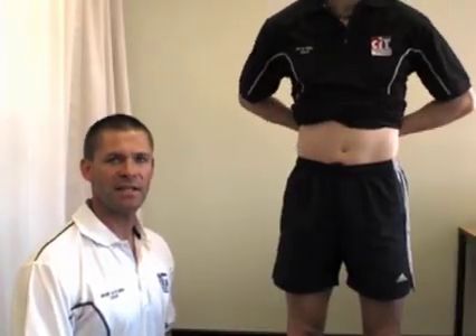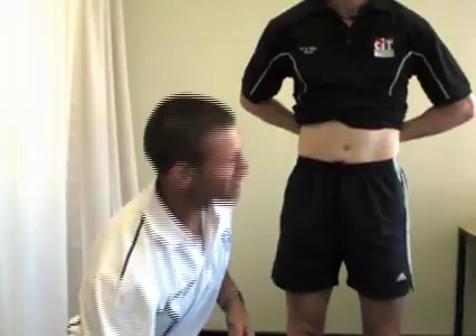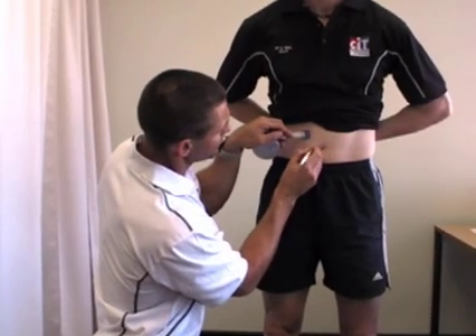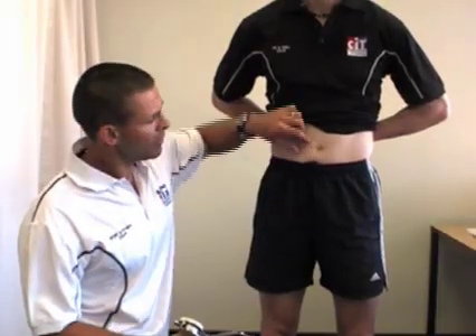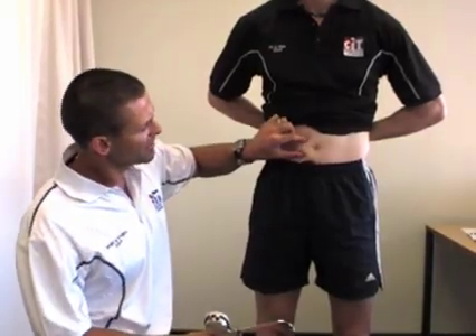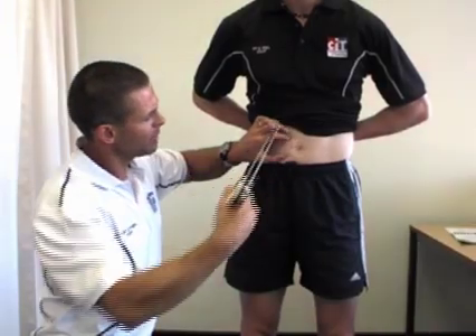The next skinfold is the mid-abdominal. All we need to do is find the umbilicus and measure roughly 30mm or 3 centimetres across from it, then make a mark. When doing the mid-abdominal skinfold, depending on the client's size and fat distribution, it may be easier to take either a horizontal or vertical fold. Procedures say to take a horizontal fold, so we'll do that today. On that point, we pinch the skin, come up underneath, take the reading — for Simon today it's 22.6mm — then simply release.